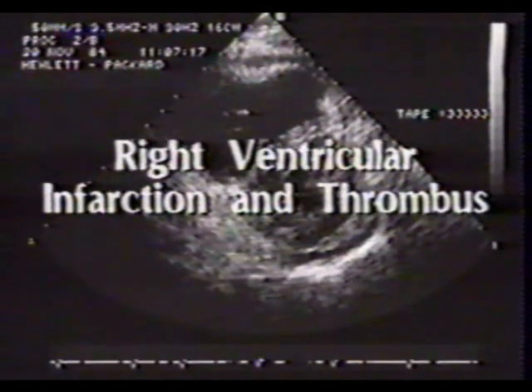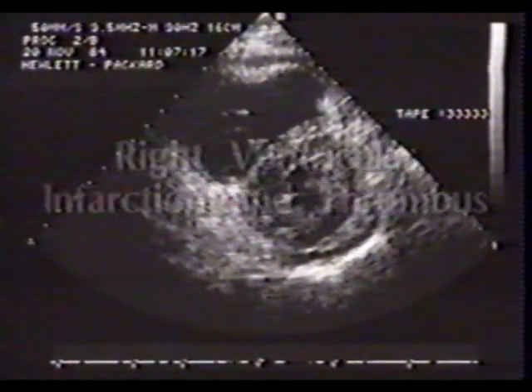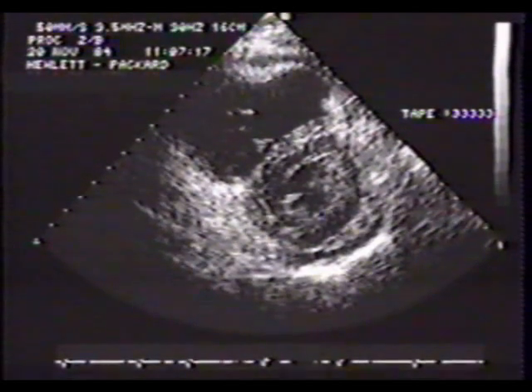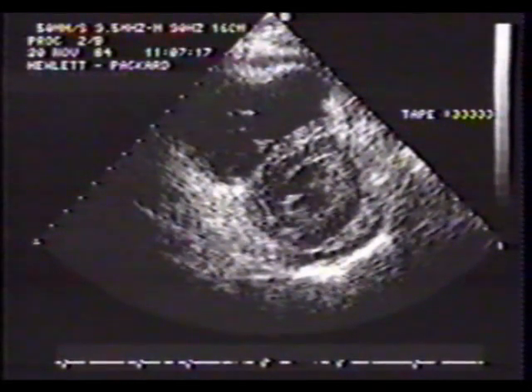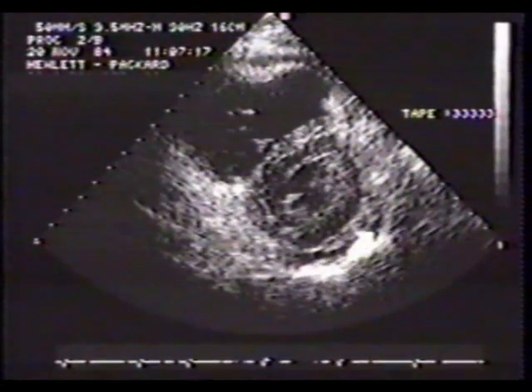This 70-year-old female was admitted to her local hospital with an acute inferior myocardial infarction. She remained stable and was transferred to us several days later for routine post-infarct investigations and rehabilitation. This echo was obtained to assess her degree of left ventricular dysfunction. She has a small pericardial effusion.